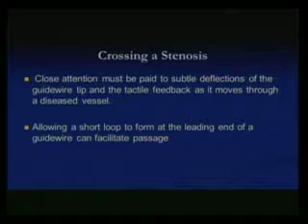So a little bit about crossing a stenosis. Whenever you're advancing the wire, you have to be very careful, even if it's a stenosis, about how the wire is going to behave. So tactile feel is very important, and looking at the image is very important, because of the subtle deflection of the guide wire and the tip, how it looks.